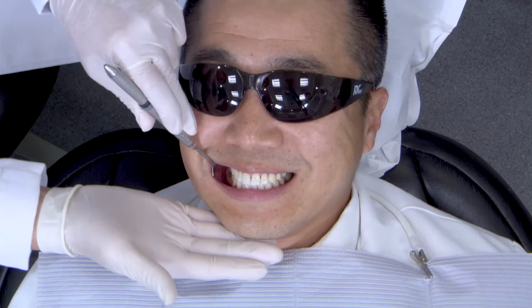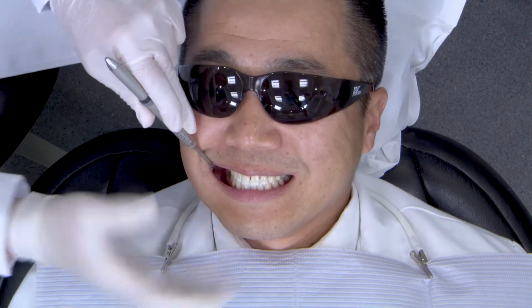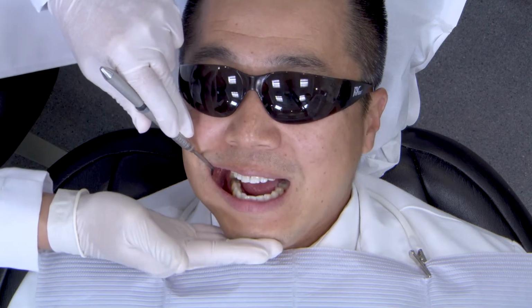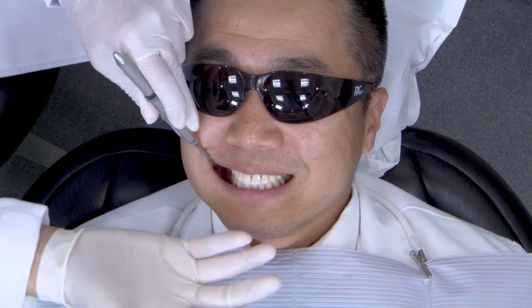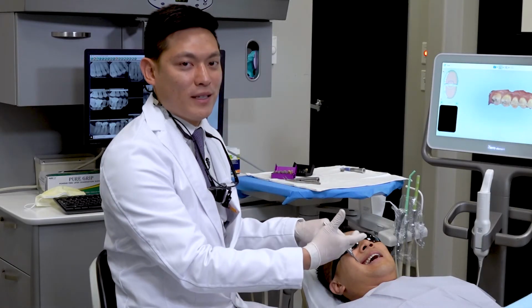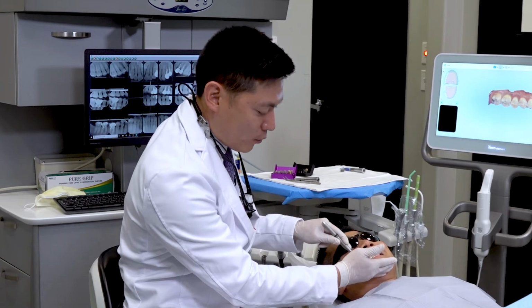So ask the patient to close together, perfect, and then make sure that you have that accurate centric position for the patient. Open again, and bite together, and bite with a little bit of pressure. Of course, it's easier when the patient is more dentate, but if they are more edentulous, it could certainly be a little more challenging. So you want to practice that with the patient beforehand.